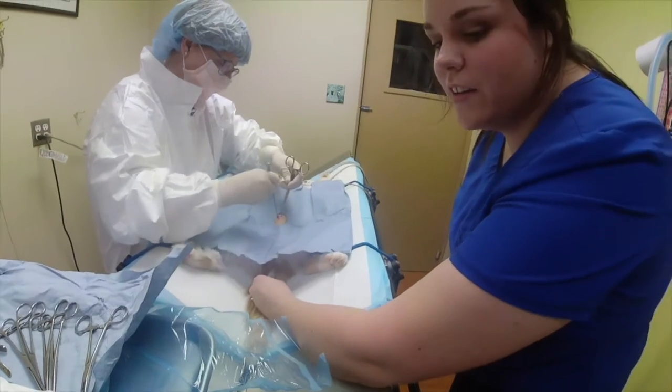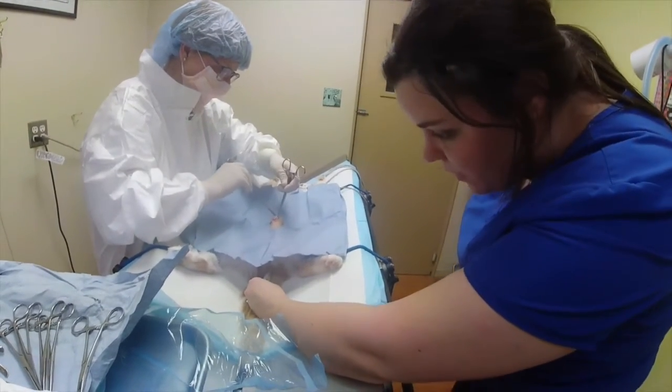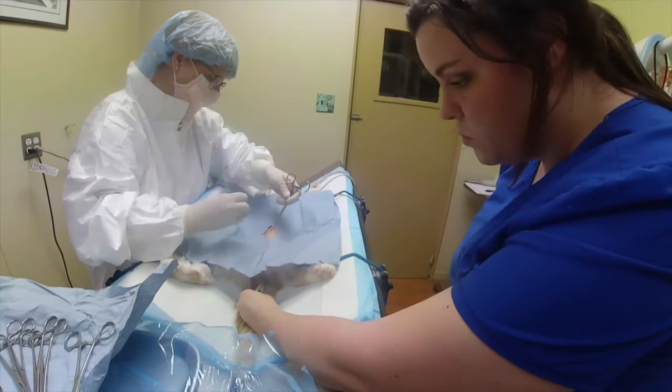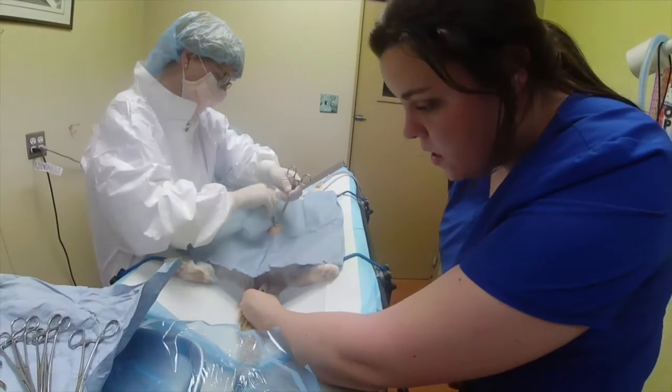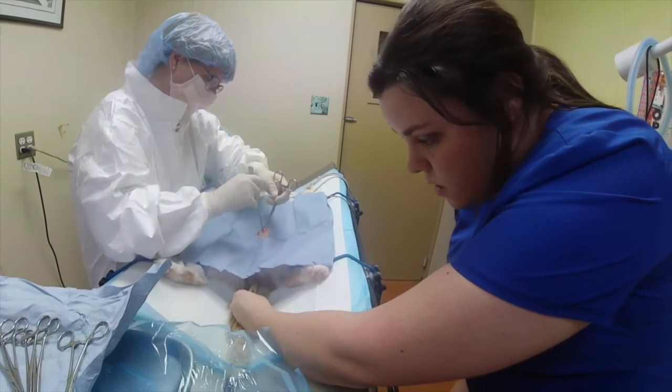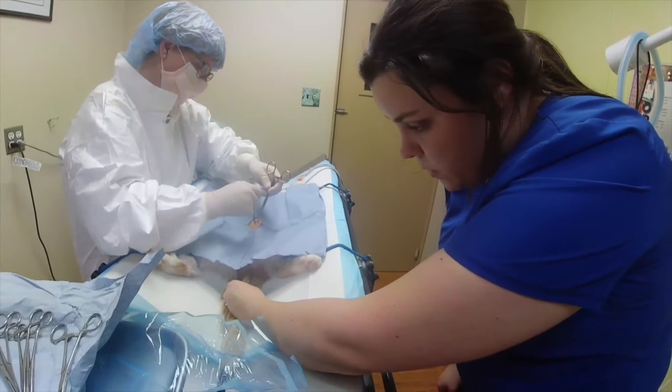It started out at 93, but it's a fast thermometer, thankfully. So normal for cats and dogs is 101.5. It'll be slightly lower when they are sedated. She is at 99.7.